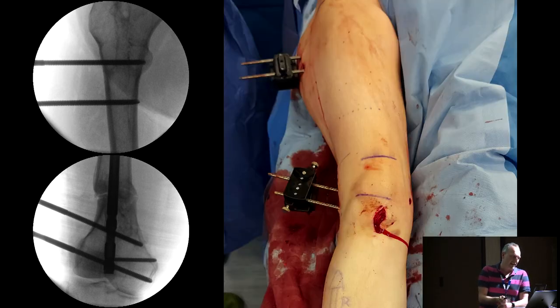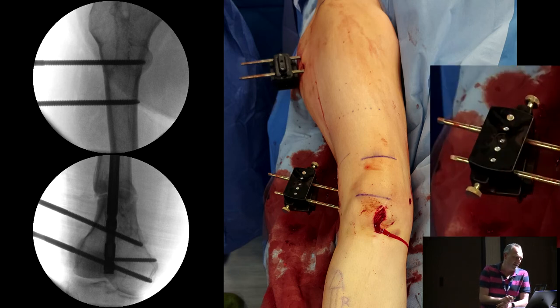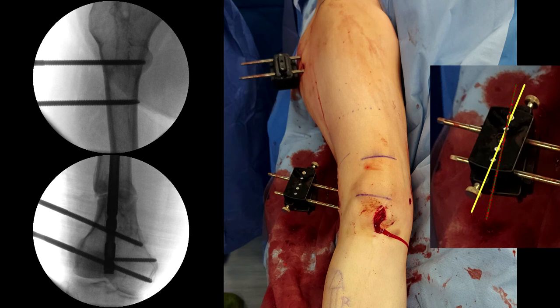And here you can see the clinical photograph of the leg. We've actually, at this point, removed the device, hence the incision on the knee. Here you can see what we've used is a rotation block. So that actually lies at 10 degrees to the axis which we will apply.